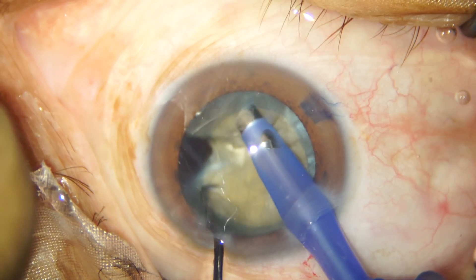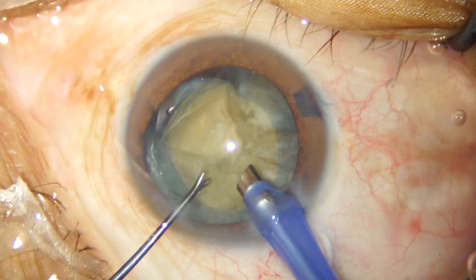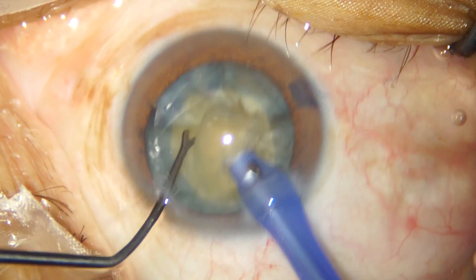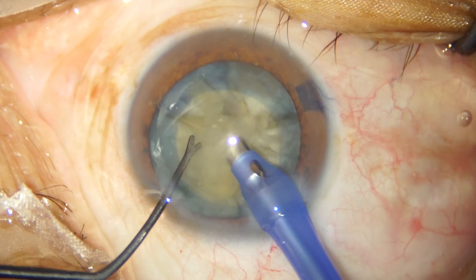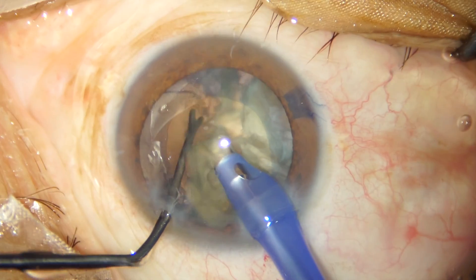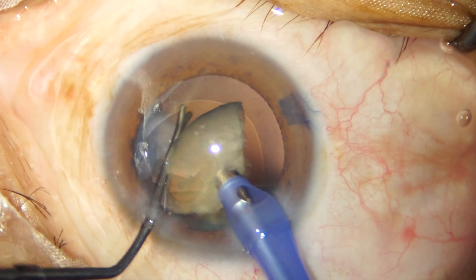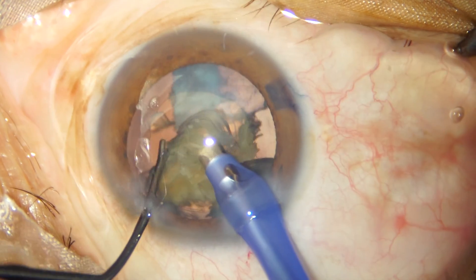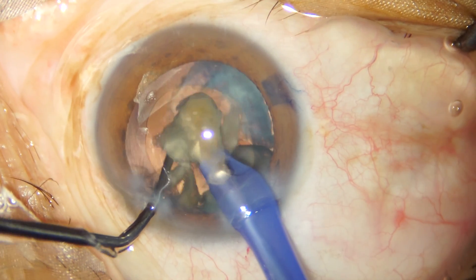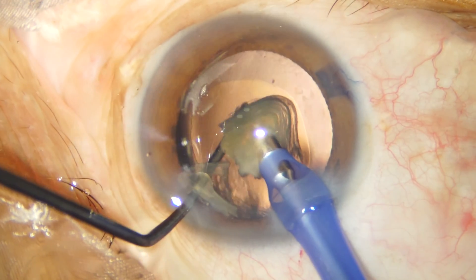As you can see, the chopping is a multi-planar chopping technique where the complete chop is achieved when the chopper goes to the deeper plane and then you do a horizontal separation to ensure that the posterior fibers are separated from the middle. FACO emulsification has proceeded routinely and in the last fragment you have to make sure that your blunt instrument is protecting the posterior capsule from trampolining upwards.